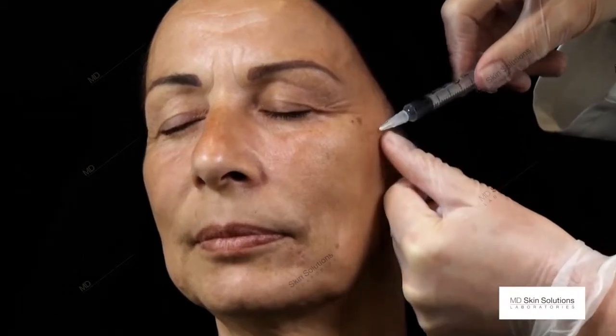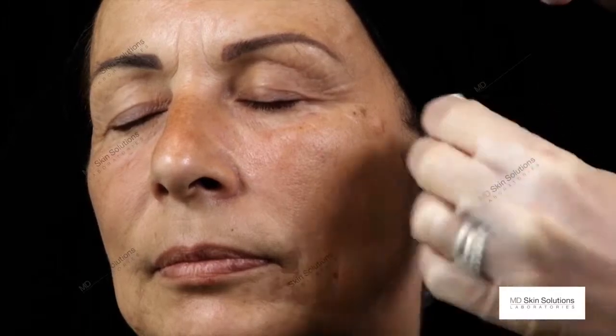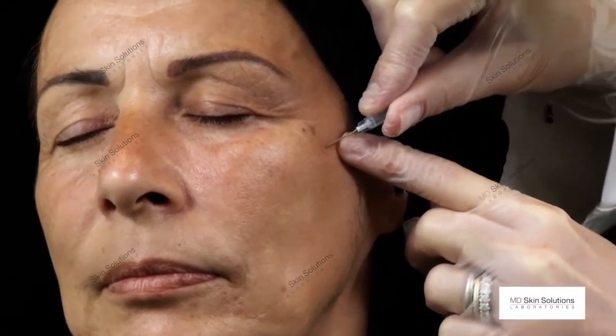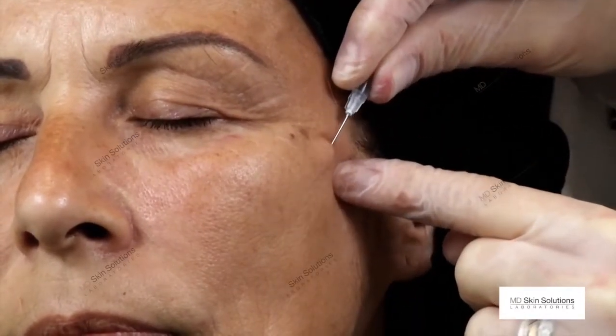To facilitate the procedure for the patient, we will numb the entry point by a little bleb. We will then use a larger needle size to make the entry hole. It's a 23. First trick is tunnel the way the cannula will move on later.